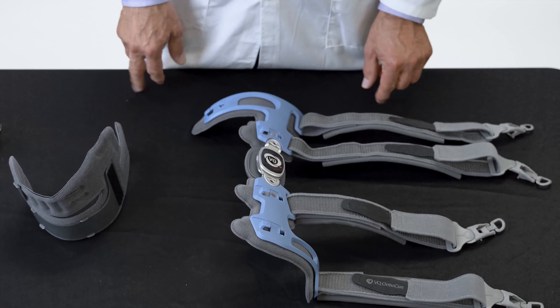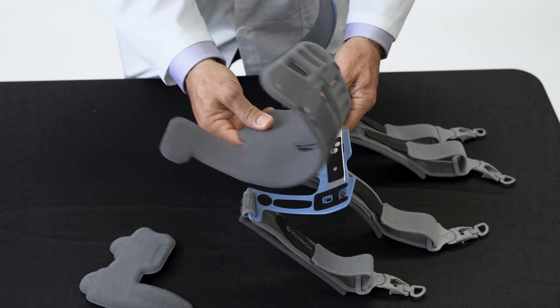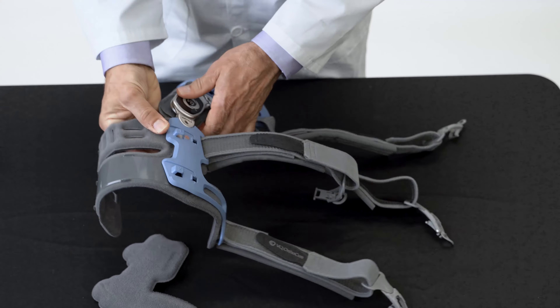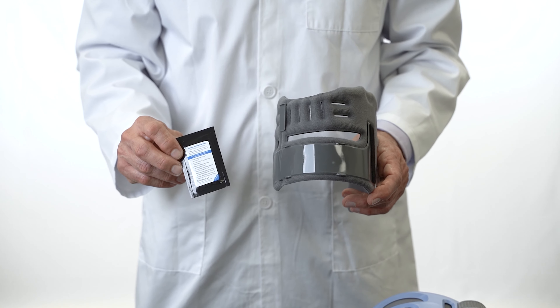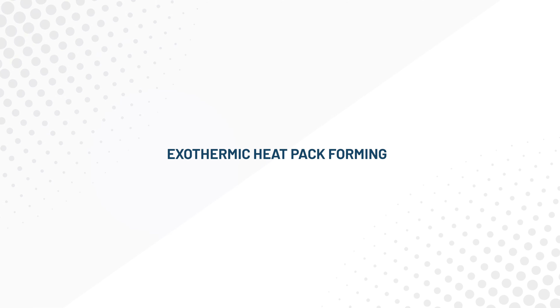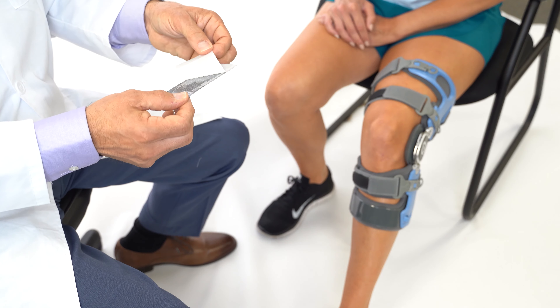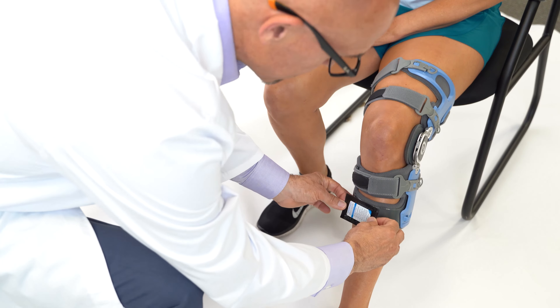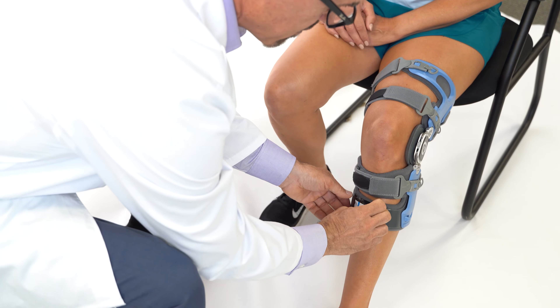To replace the calf liner, remove it and attach the anterior tibial cuff, aligning the cuff Velcro to the frame upright. The plastic insert in the cuff pad can be heat molded using the included exothermic pack or a heat gun. Peel the backing from the side opposite the label and adhere the pack to the tibial cuff plastic, aligning the center of the pack with the tibial crest. Ensure the pack does not overhang the edges of the cuff pad and touch the skin.